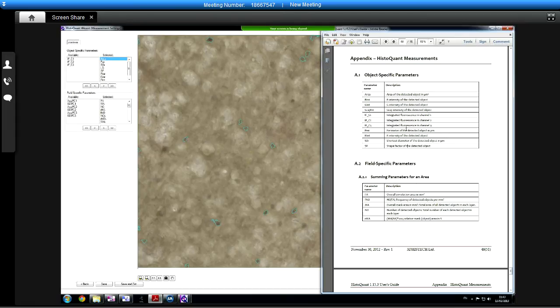Or you might find, for instance, that depending on what you're doing to the samples, the darker ones are more important of all the ones you're selecting. And for instance, something like the grey intensity or for a particular type of stain, the red intensity might indicate that also. So it's just worth bearing those in mind, if you're thinking about how can I get to where I want to be, it's not always a case of mimicking exactly what you might do manually. It might be a case of going, well, based upon the possible measurements, which one is actually a really good indicator, and there's ways which we'll look at in a moment of how you can help yourself get to that point.